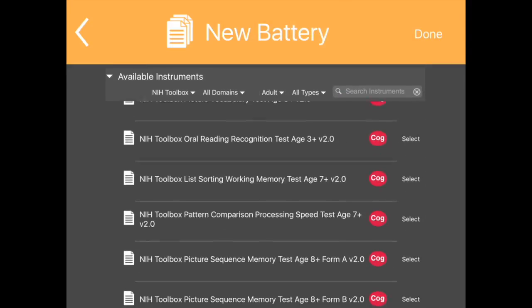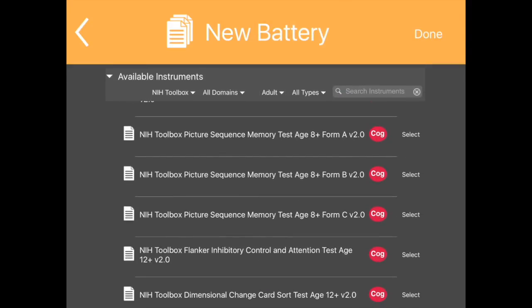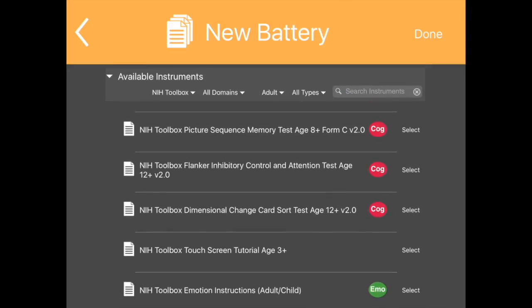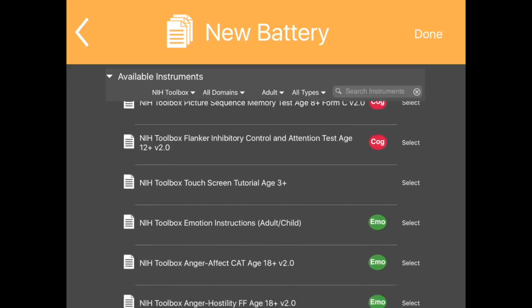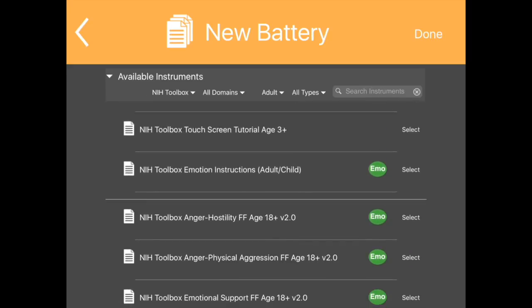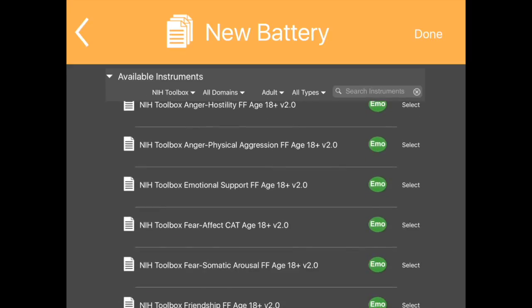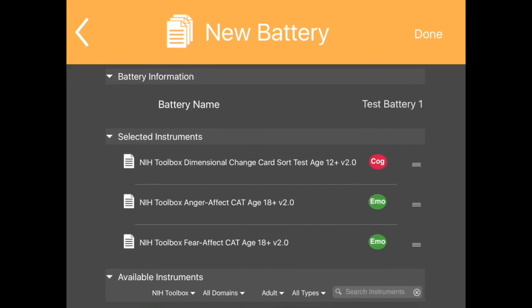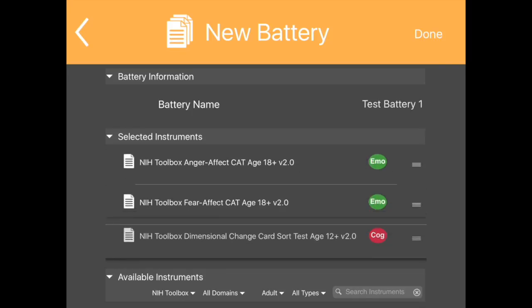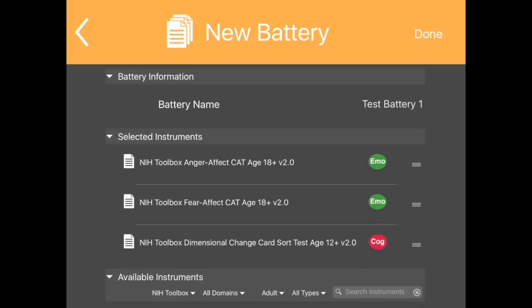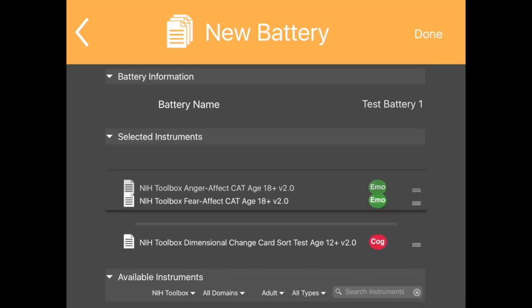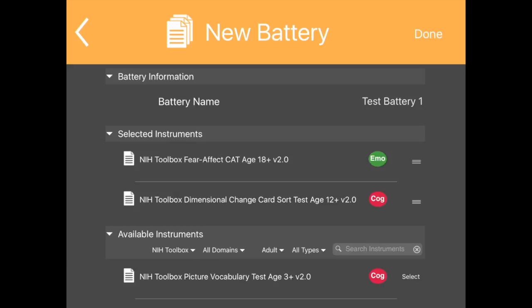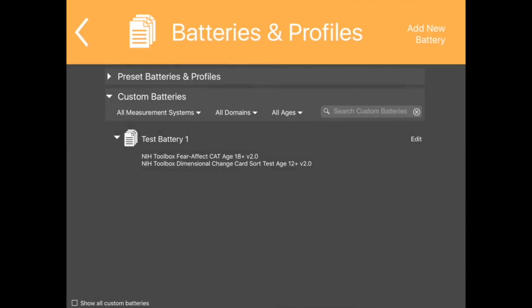Selected Instruments will move to the upper part of the screen and be listed under Selected Instruments. Reorder the selected instruments by dragging them up or down using the symbol to the right of the instrument name. Tap Done in the upper right corner of the screen to save the selection and return to the previous screen.